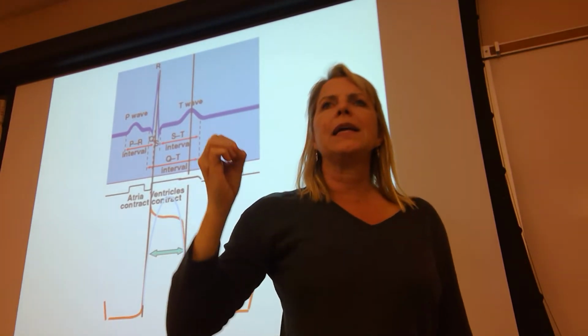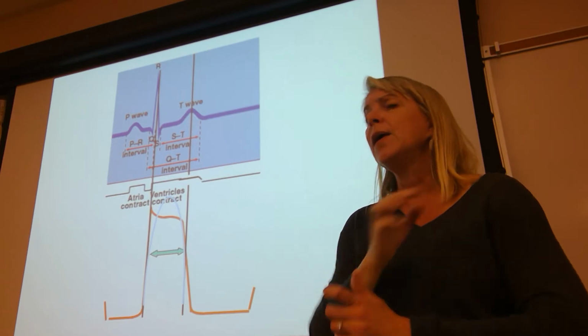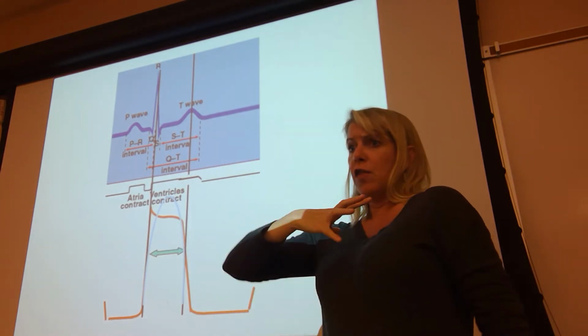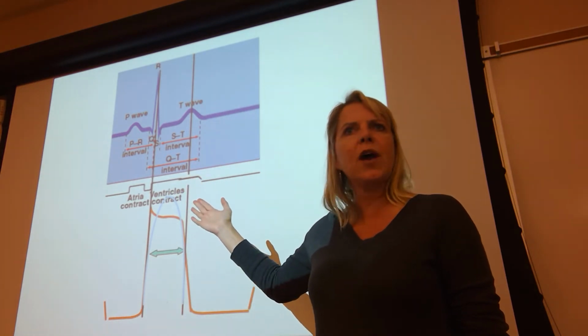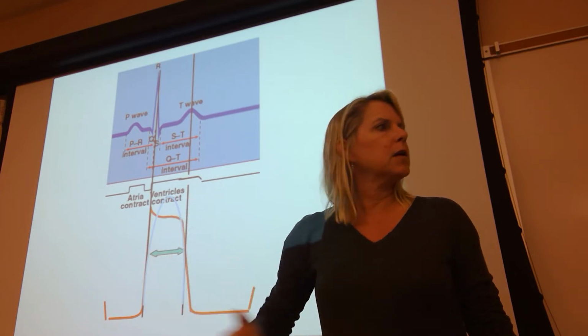Isn't that misleading? We see a flat line. We think nothing is happening, when in actuality, if we could cut open our patient's sternum and look at their heart, their ventricles would be going, and that is when we would be getting stroke volume, ejection. Kind of cool, right?